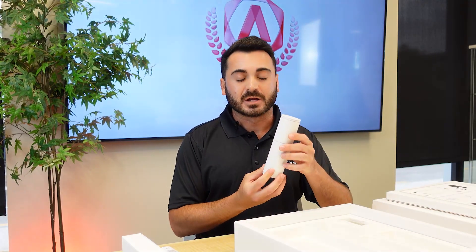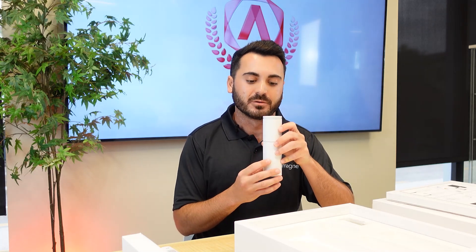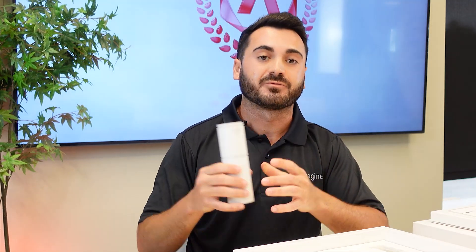Moving on, we have our actual calibration tool. This tool is much similar to previous versions that Medit has come out with, but is actually not interchangeable — it only works with the i900 model. The calibration is usually meant to be done every three months, which although is not calibration-free, it is much less frequent compared to other models and scanners.